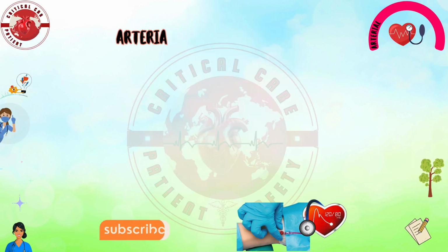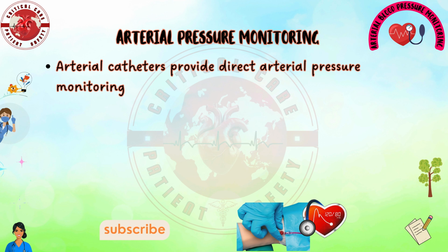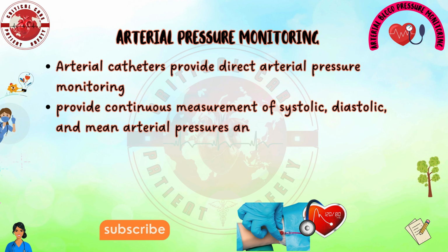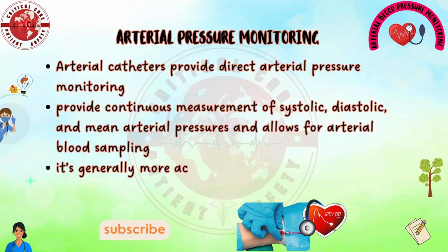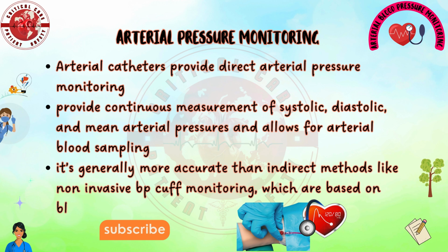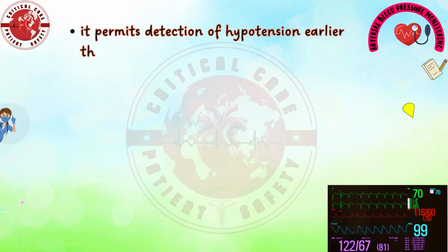Arterial pressure monitoring. Arterial catheters provide direct arterial pressure monitoring. They provide continuous measurement of systolic, diastolic, and mean arterial pressures and allow for arterial blood sampling. It's generally more accurate than indirect methods like non-invasive BP cuff monitoring, which are based on blood flow. It permits detection of hypotension earlier than indirect monitoring techniques.